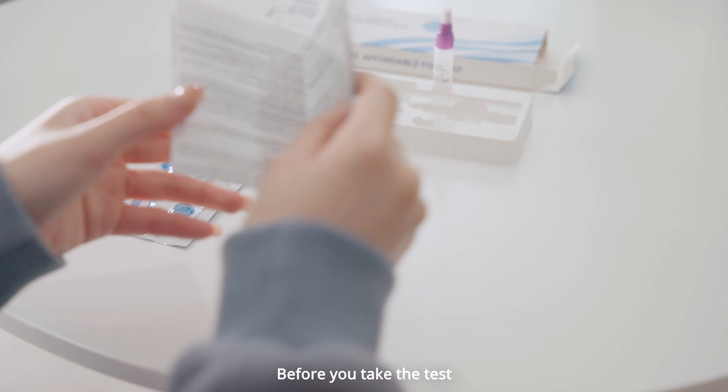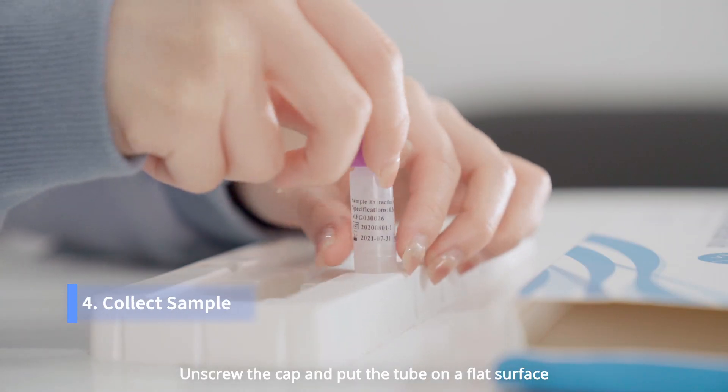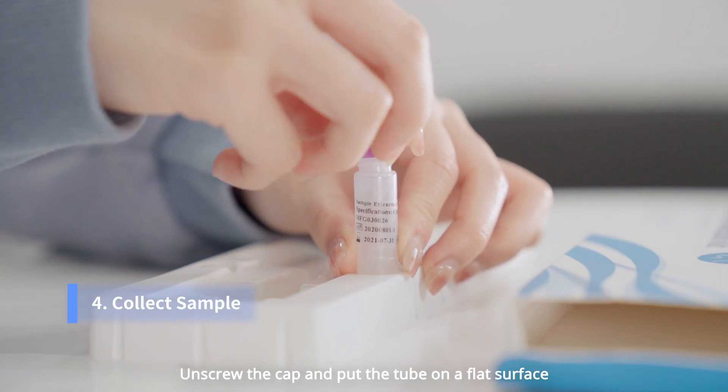Before you take the test, please read the user manual in your kit carefully. Unscrew the cap and put the tube on a flat surface.